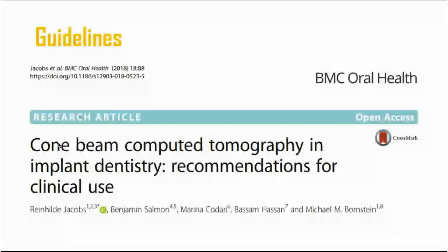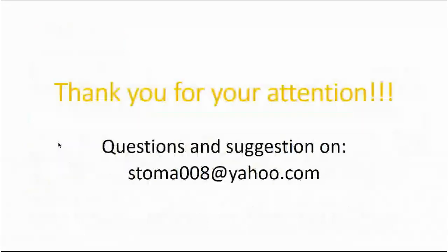Also, one of the latest articles I have read is a really good overview of the current recommendations for the clinical use of cone beam in implant dentistry. It is this one from the author with surname Jacobs. You could look for it to supplement this presentation with the latest recommendations in our field.